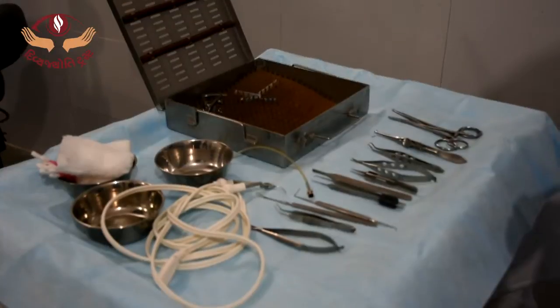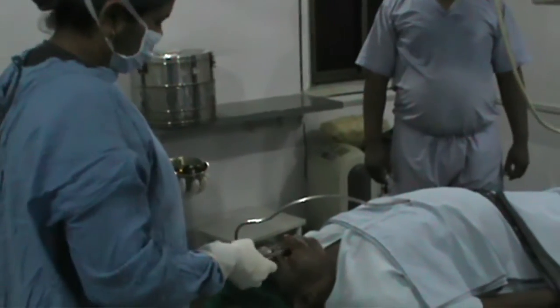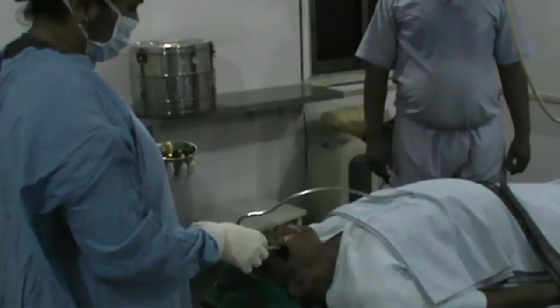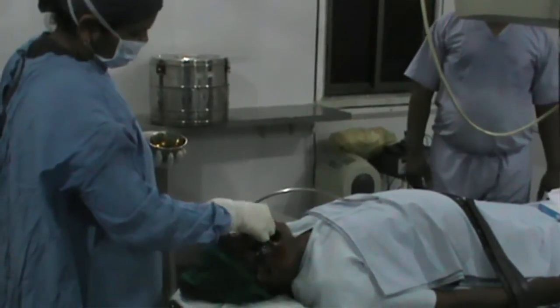Instrument must be placed over it with tips facing up, on the table. Paint povidone iodine 10% for 3 minutes on the skin and periorbital area, boundary, hairline, tip of nose, nasolabial fold and ear on the side of the eye to be operated.